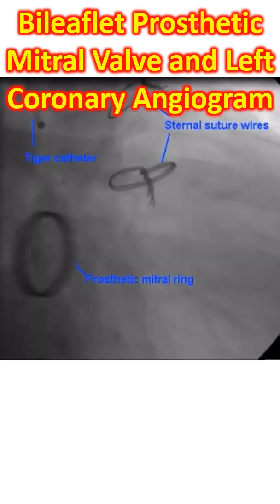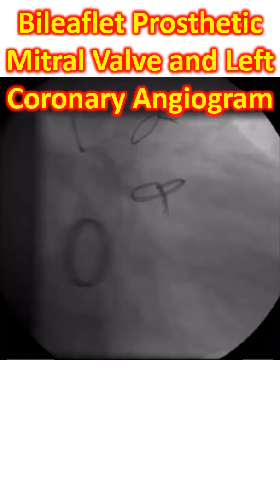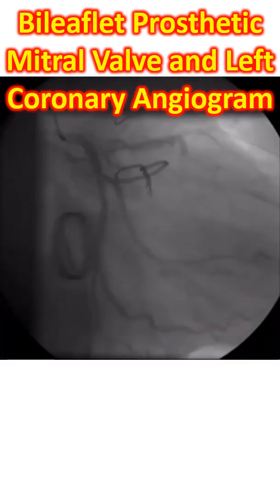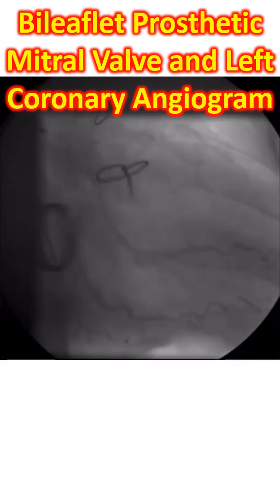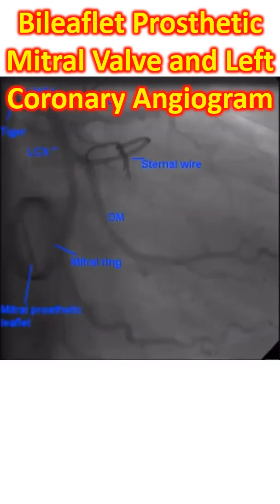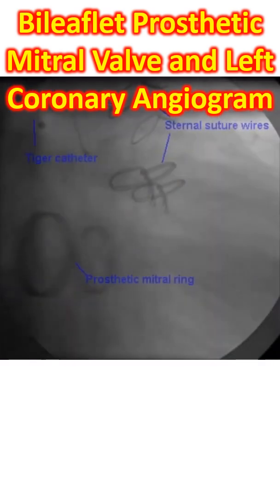Here the valve ring is seen in a different plane. You can see the coronary angiogram as well in the background. This is a still image of the coronary angiogram showing the various branches of the left coronary artery.